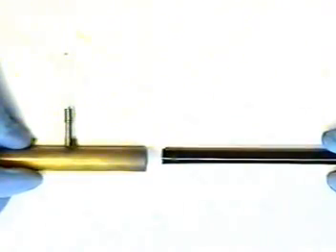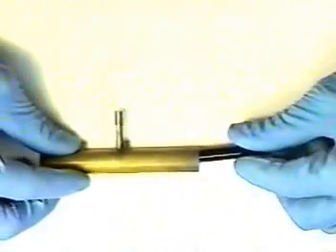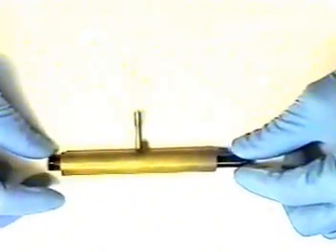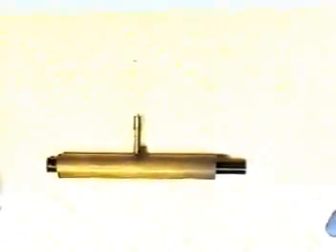We will now prepare the 9.8 millimeter bending rubber sheath to apply over the bending section of this Olympus gastroscope. Using a 9.8 millimeter vacuum jig, we will slide in the 9.8 millimeter bending rubber sheath, which is particular to this endoscope.